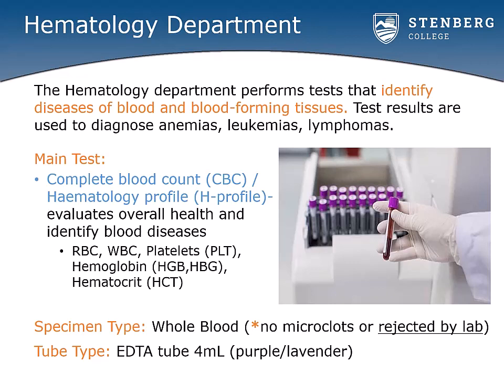The tube of choice for the CBC test is the 4 ml EDTA tube, which is purple or lavender, as seen in the photo, along with the hematology analyzer loaded with samples waiting to be tested for CBC. Any small clumps containing multiple cells will be counted as one cell and will skew the results. Therefore, the EDTA anticoagulant must be mixed with the blood immediately to avoid microclots happening. Tubes containing microclots will be rejected when they're delivered to the lab and will need to be recollected.